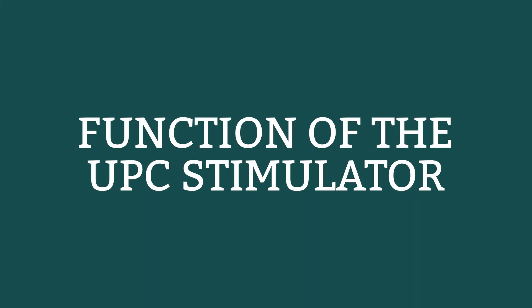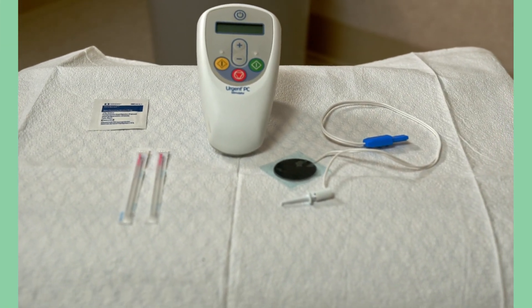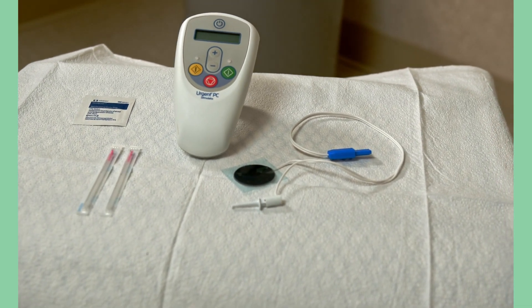Before we begin the in-service, let's go over the function of the stimulator. This is the urgent PC stimulator that we use to deliver the PTNS treatment here in our office.